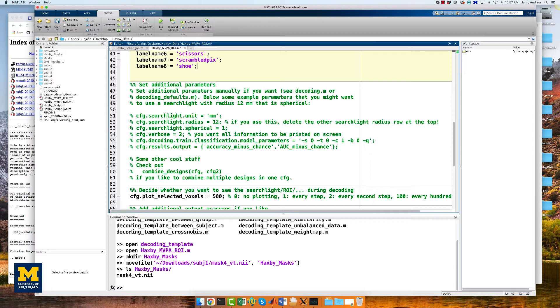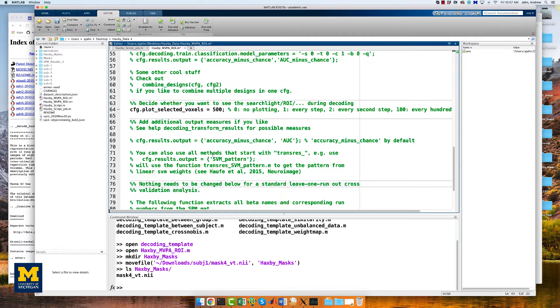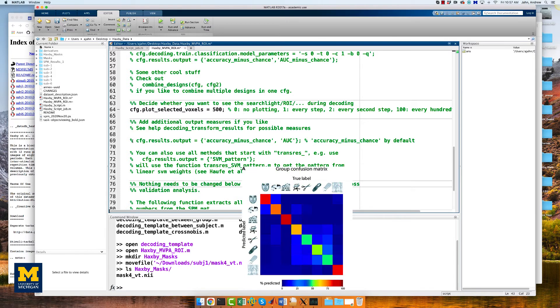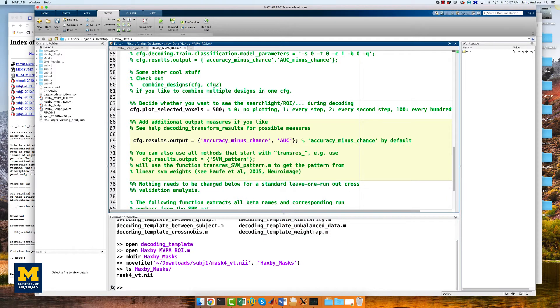Line 69 indicates the output you want from the analysis. The default is accuracy minus chance. A more useful output is a confusion matrix, which shows how accurate the classifier is at identifying each condition correctly. We will uncomment that line and change it to confusion_matrix, using an underscore between the two words.